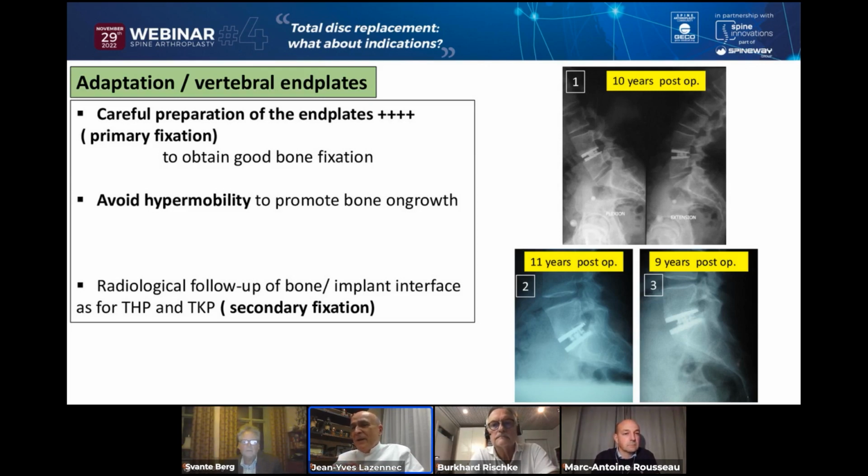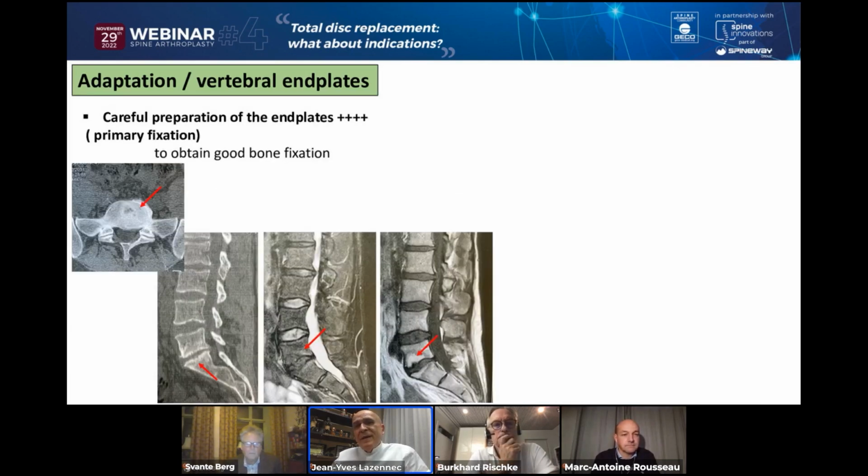The L5S1 end plate very often is relatively silent, and sometimes may have some radiolucent line, as you can see, for example, in case 2. Is it dangerous? Is it a problem? We have to speak about this. Look at those X-rays. Most of the time now, we look at MRI, but we miss a very important thing.